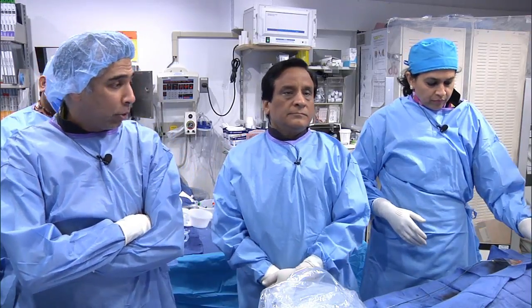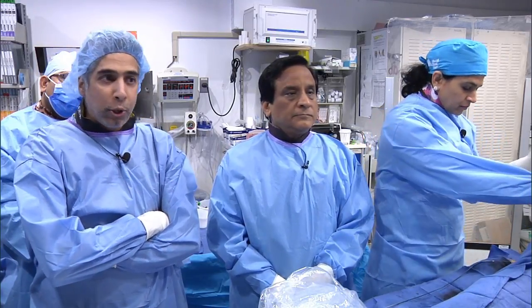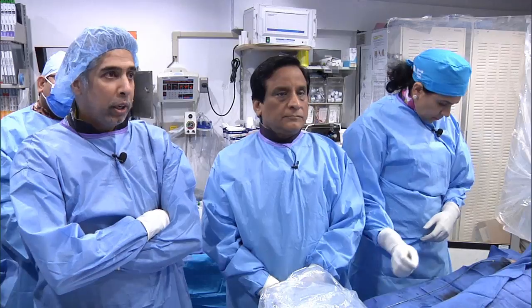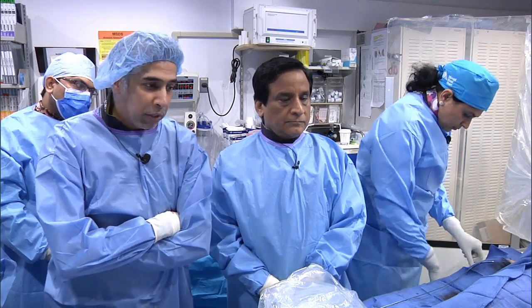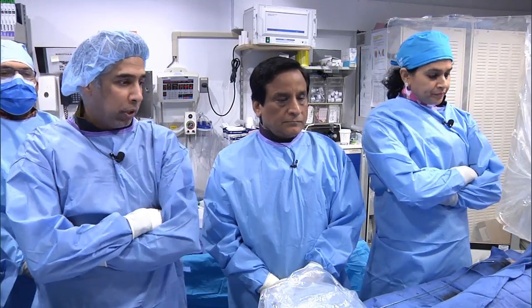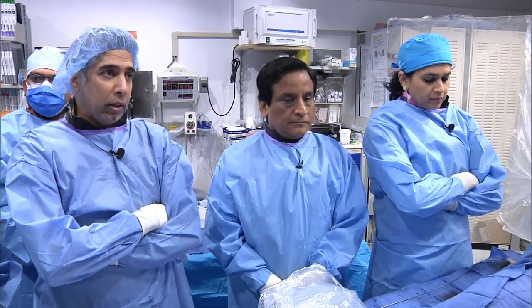One of the big downsides of transradial procedures, or at least perceived downsides, are increased procedure time, contrast use, and specifically radiation exposure. And that might have been one of the barriers that has limited uptake, in addition to some things that are intrinsic in the educational structure. Certainly there has been some more recent data that does confirm there is a higher radiation exposure. Although, as we'll see when Dr. Sharma presents in his slides, the difference between transradial and transfemoral radiation exposure is narrowing with time.